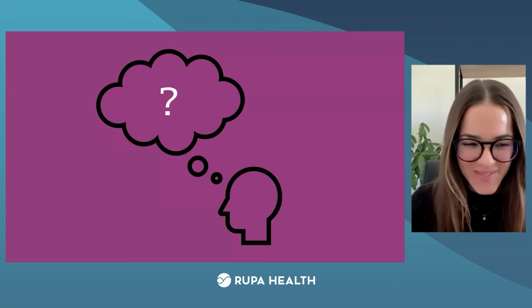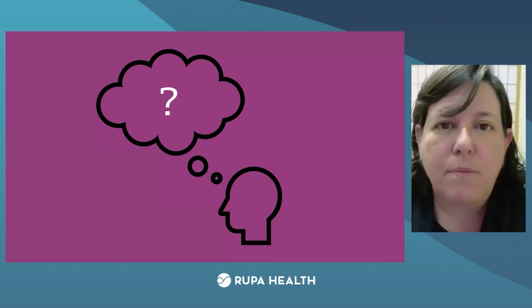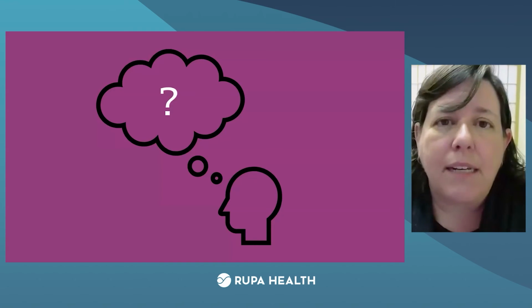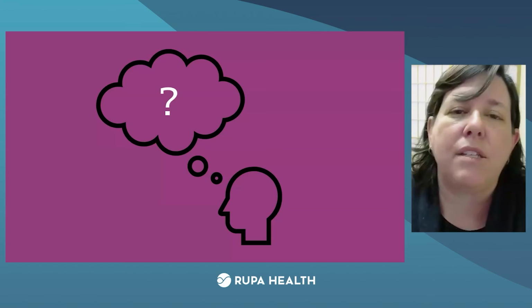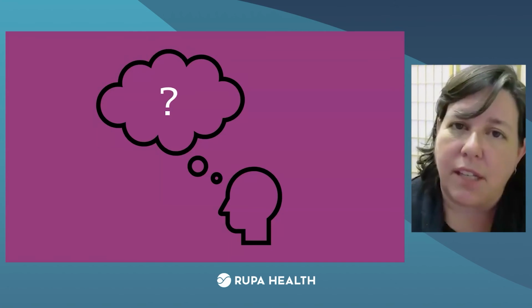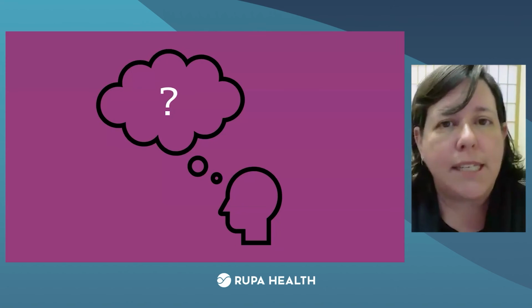Sounds good. So I had a question about reliability with blood spot versus serum. Blood spot's super reliable, like I said, but we are dependent on the quality of the spots that we have. So it is important that people do read the instructions. It is important that they just give us single spots, but we should see the same.